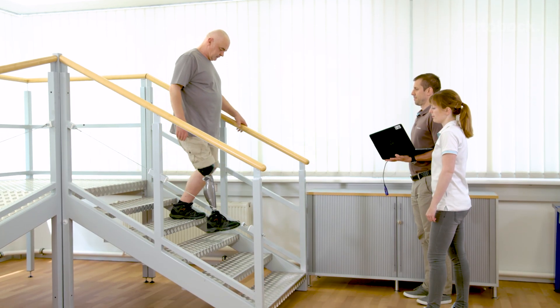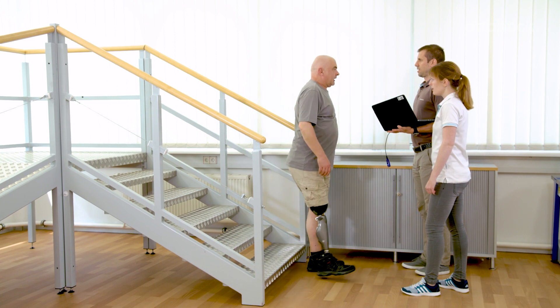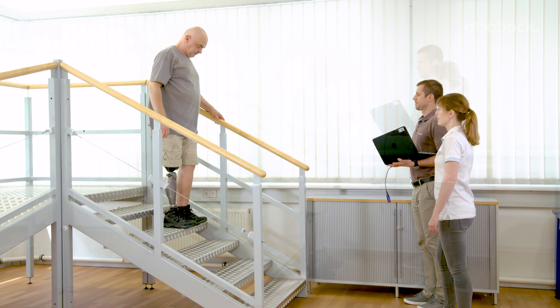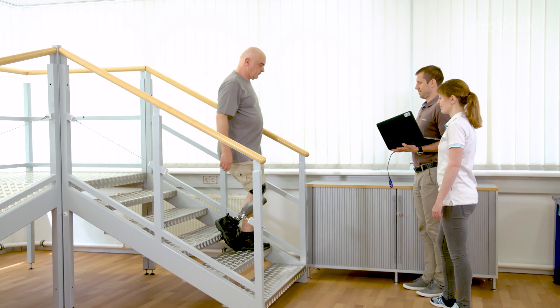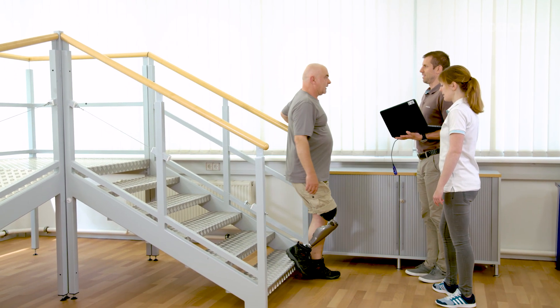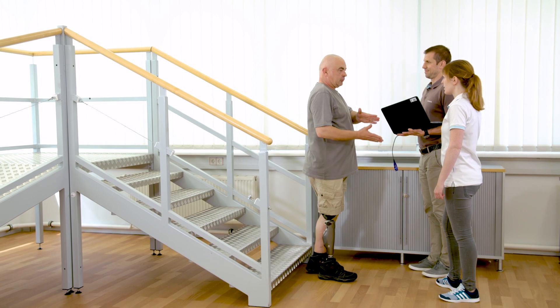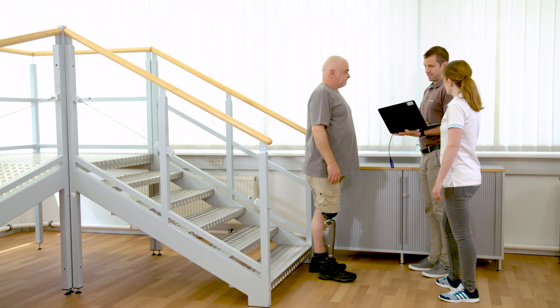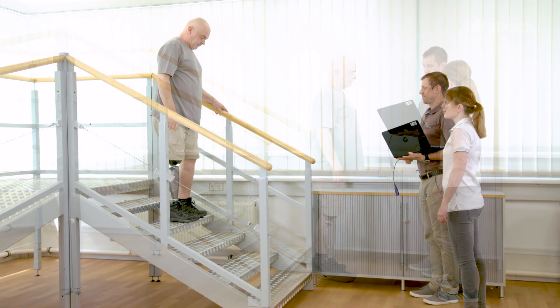Resistance is too low — knee flexion happens too fast. Gerhard feels no support and lands on the left foot without support. Too much resistance — knee flexion is too slow and seems difficult. Gerhard feels insecure. Alexander changes the resistance back to an adequate value.